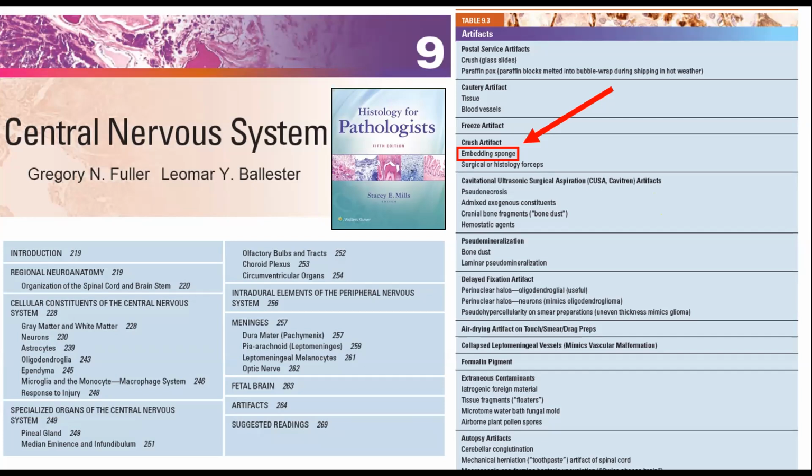One of the most prevalent is cautery artifact for brain tumors. Now, cautery artifact in its most severe form is easy to recognize. The tissue is totally distorted. The vessels are purple. It's unrecognizable. It's uninterpretable. That is not a problem. That's fine. The problem is further away. As you move away from the cautery, the epicenter, the focus, the effect becomes less and less pronounced, but the distorting aspects will still be there.